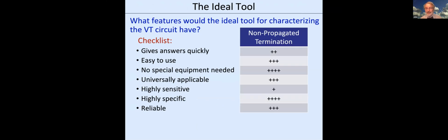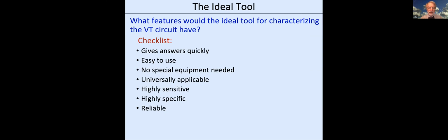Does it give answers quickly? Well, if you're targeting where you're going, it's reasonably good. You can't just do this all over the place. You have to do diastolic signals and say, is this going to work? Is it not going to work? Pretty easy to use. Even people with a small attention span can look at one beat and do pretty well. You don't need any special equipment. It's not universally applicable because you got to have VT that lasts long enough to do this. Not very sensitive, but is extraordinarily specific and quite reliable. I don't think I've seen this fail me before.